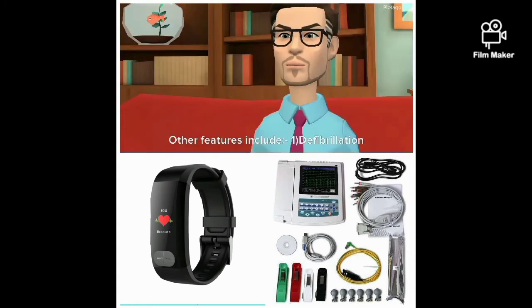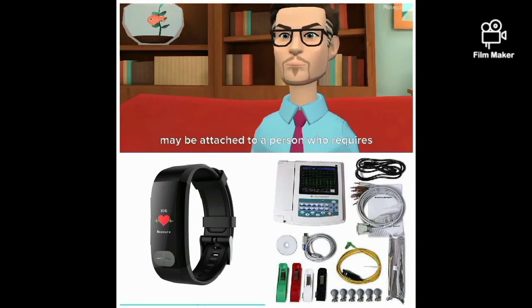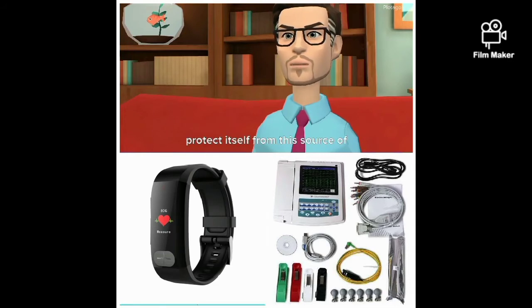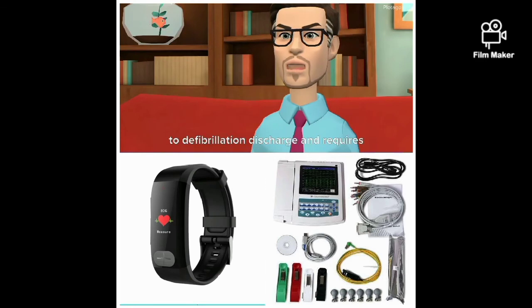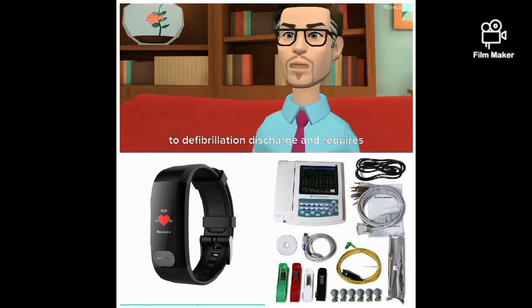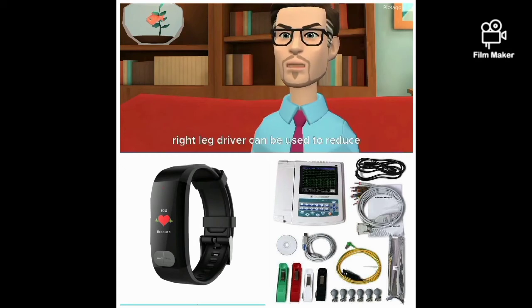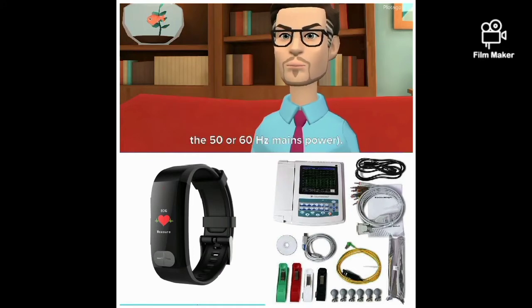Other features include: 1. Defibrillation protection. Any ECG used in healthcare may be attached to a person who requires defibrillation, and the ECG needs to protect itself from this source of energy. 2. Electrostatic discharge is similar to defibrillation discharge and requires voltage protection up to 18,000 volts. 3. Additionally, circuitry called the right leg driver can be used to reduce common mode interference, typically the 50 or 60 Hz mains power.